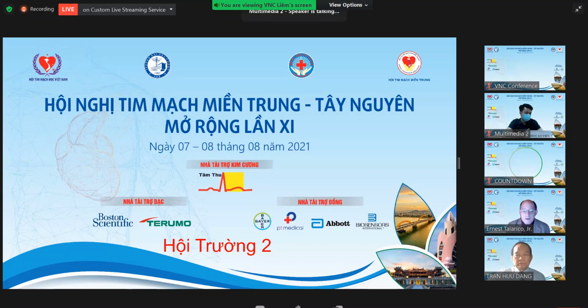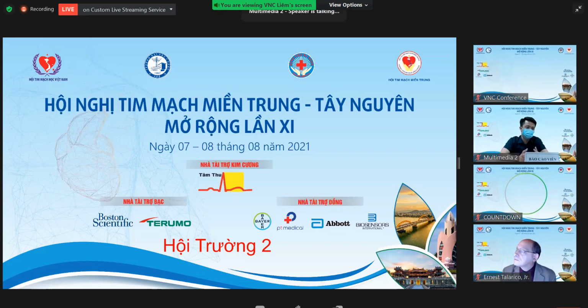Okay. During our research, we see the muscle shorten much more in the longitudinal strain. I mean, much of the ventricular contraction consists of longitudinal and circumferential movement. So in patients with coronary syndrome, we observe that the longitudinal strain is more affected. According to some research, they also stated that there is statistical significance showing that the longitudinal strain is more affected.